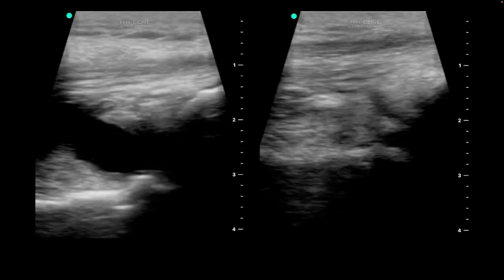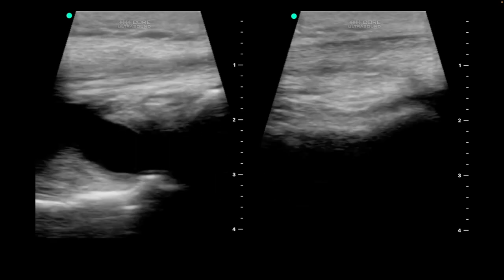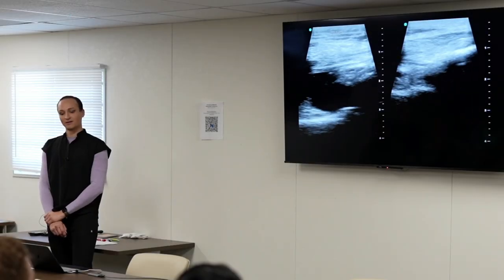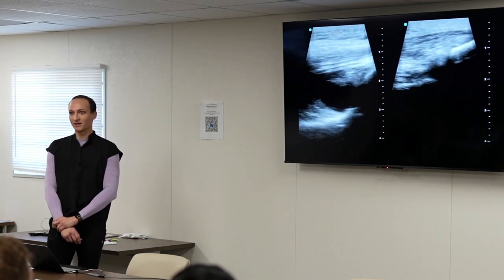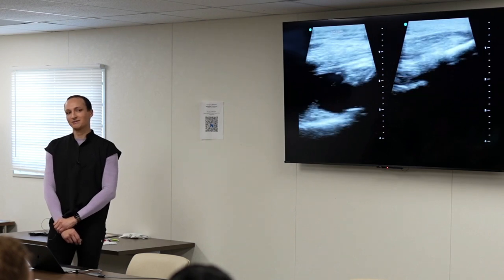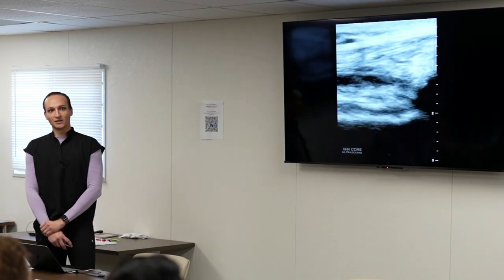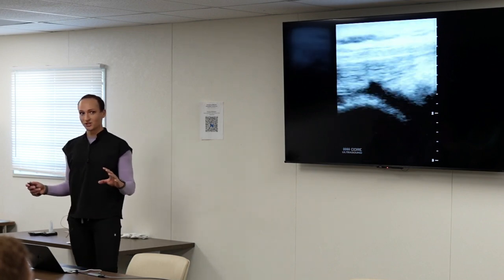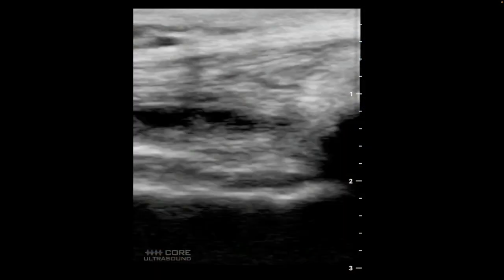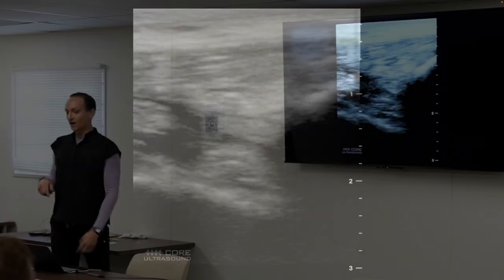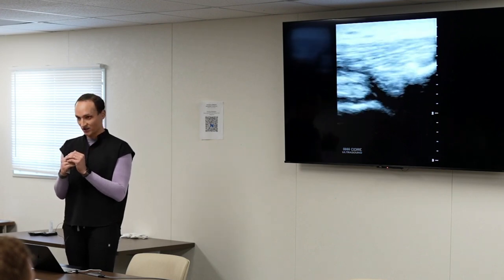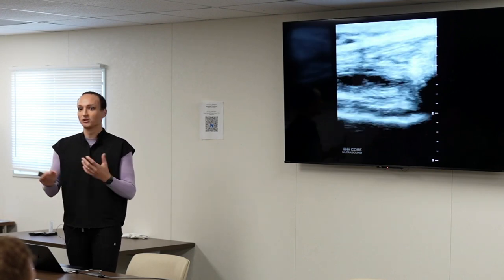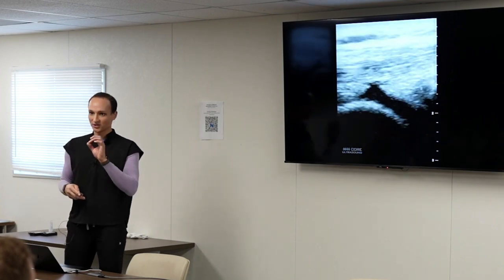This is my own knee, after my meniscus surgery. The orthopedic surgeon said I could do whatever I wanted, so I got on my bike for 30 minutes the day after surgery — and this is my knee after that ride. I probably shouldn't have done that, but that's what an effusion looks like. This is a very dynamic examination: flexed versus extended changes the appearance significantly. The standardized approach is with the knee in about 30 degrees of flexion — that's the most sensitive position to detect an effusion.